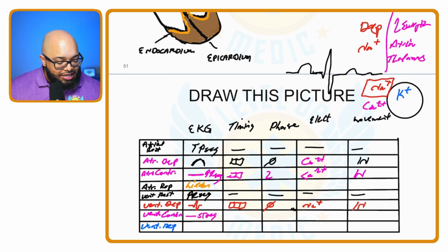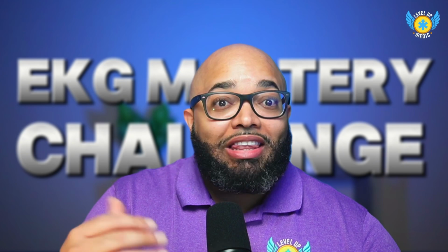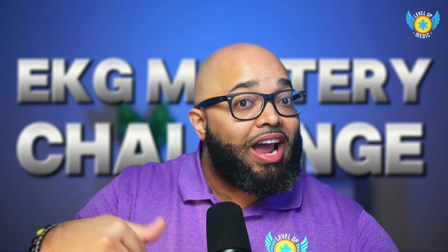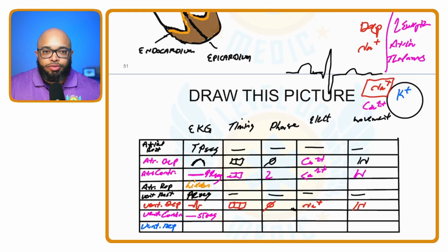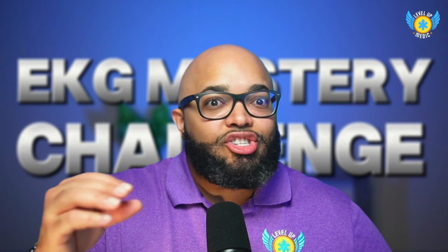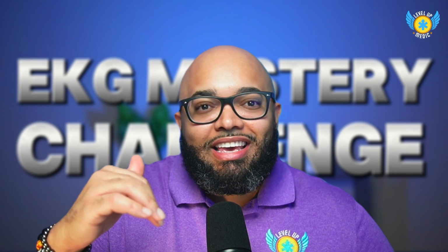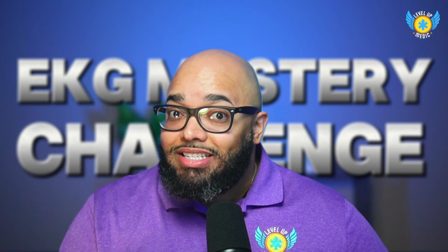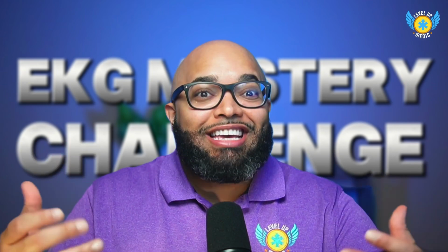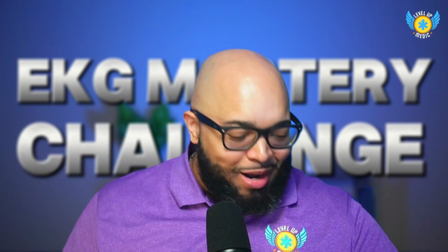Of course, that ST segment is what we also look at, for instance, in the setting of figuring out an MI, which is going to be our last step of our 6-step process. So we're actually going to get to that coming up. When we're getting to the STEMIs and non-STEMIs, I may even tell you not just what a STEMI is in terms of is the ST segment elevated or depressed, but I'm going to tell you what it actually is in the body. So stay tuned for that. That's coming up later today.